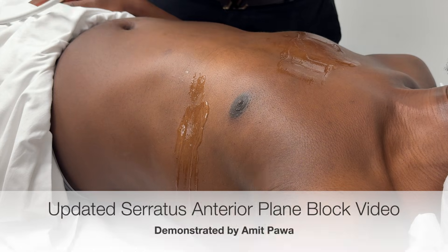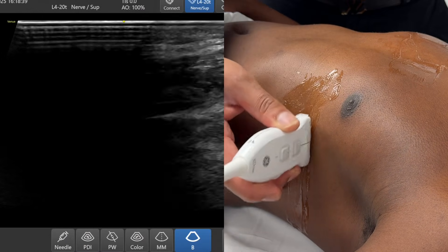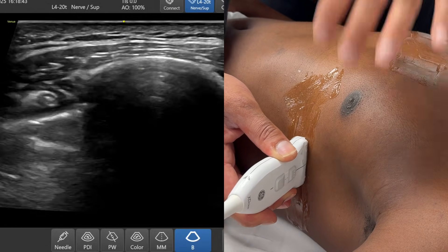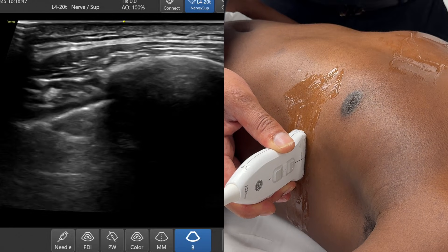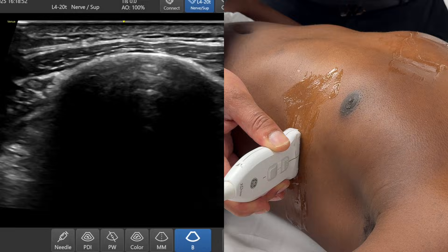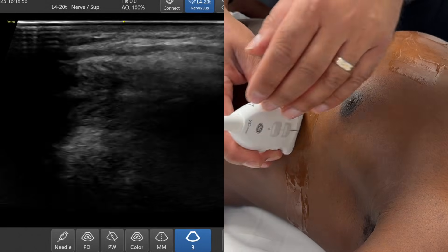I've got a patient model lying supine, and I'm using a high-frequency linear probe. The first thing I want to do is place the probe on the anterolateral aspect of the chest. The reason we perform a serratus anterior plane block is to get the lateral cutaneous branches of the intercostal nerve. It can be used for rib fractures, but also for anterolateral chest wall analgesia.